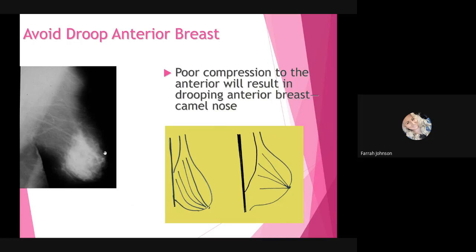So, just like with your CC, you want to lift that breast up to a 90-degree angle if possible. And then as you compress, don't let go until the breast starts to stay in place. Because as soon as it starts to droop, you're not going to get adequate compression.